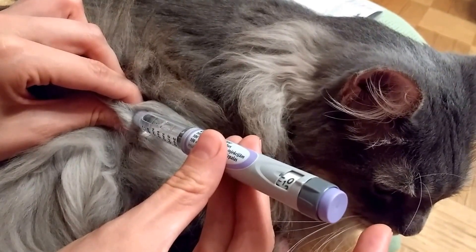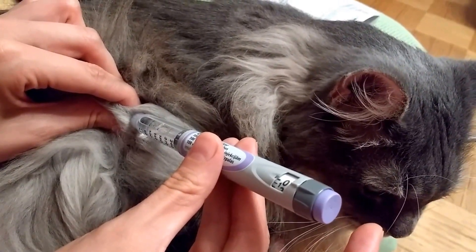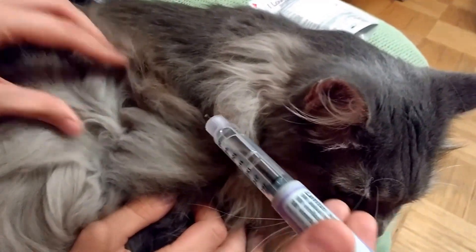You can hold longer, but not less than 10 seconds — otherwise all of the liquid doesn't come out. Then you take it out and it's done.